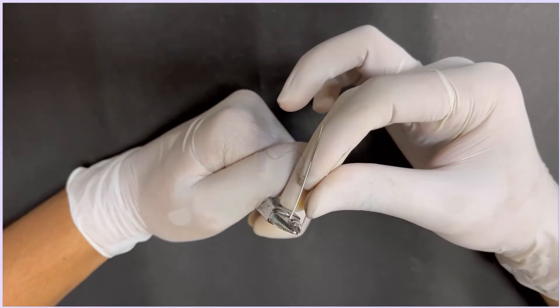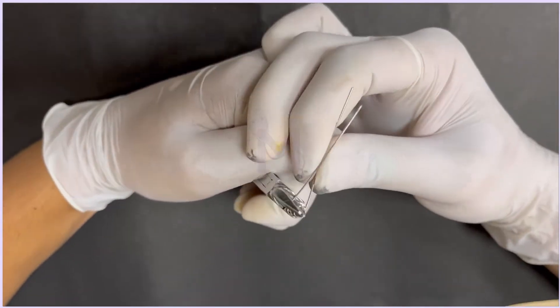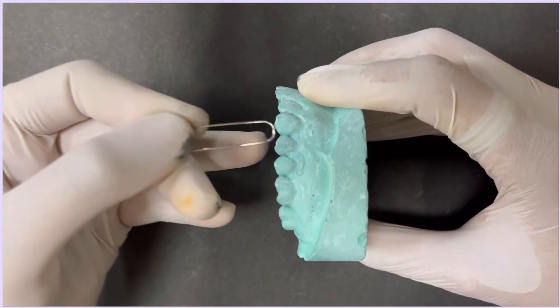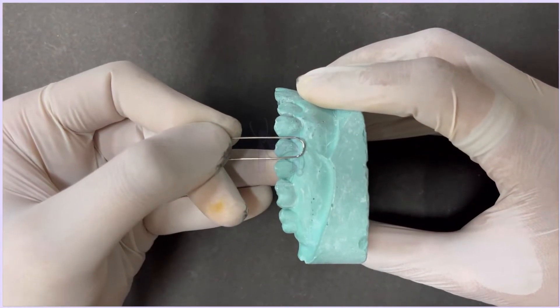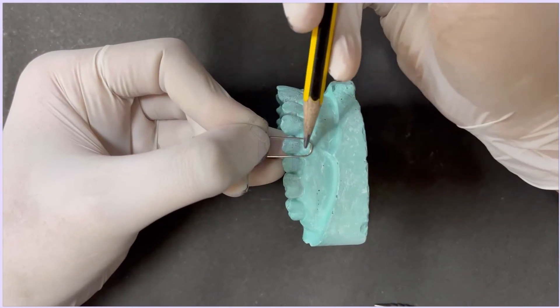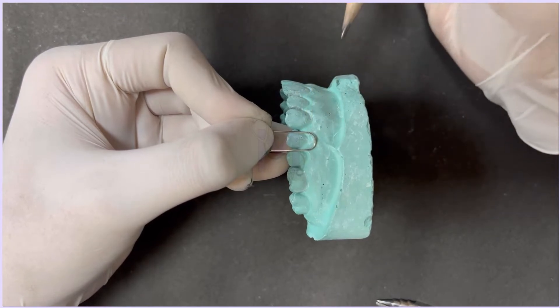To fabricate a U-loop, first we'll bend a piece of straight wire around the bottom part of the universal plier to get a U-loop. Make sure this U-loop adapts to the mesiodistal width of the buccal surface of the first premolar. The base of the U-loop should be placed about 2-3 mm below the cervical margin of the first premolar.